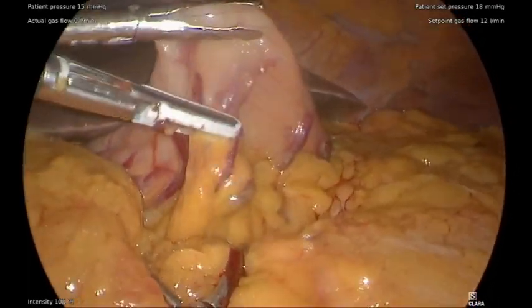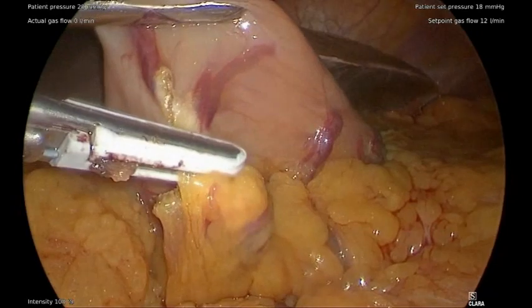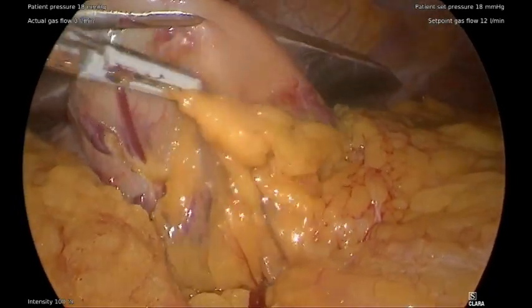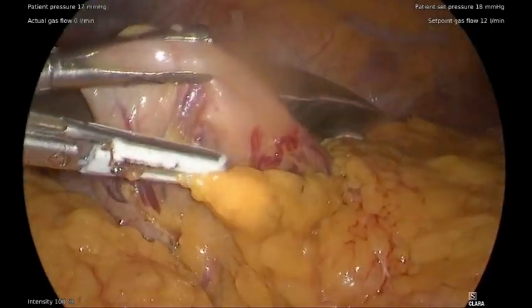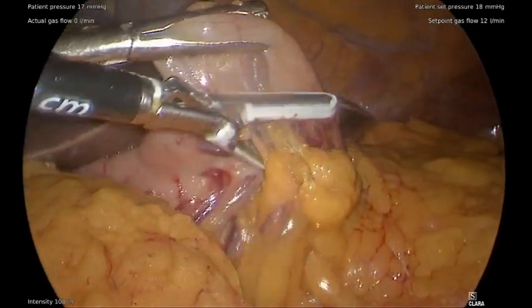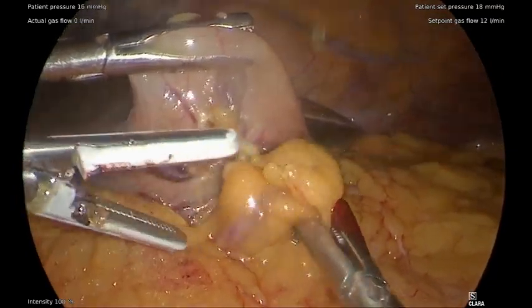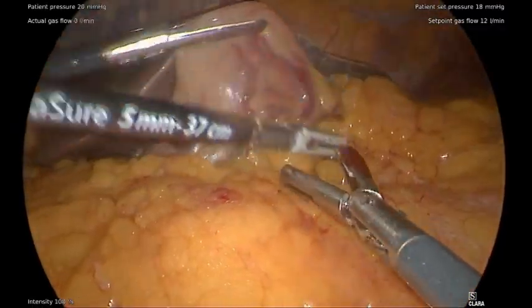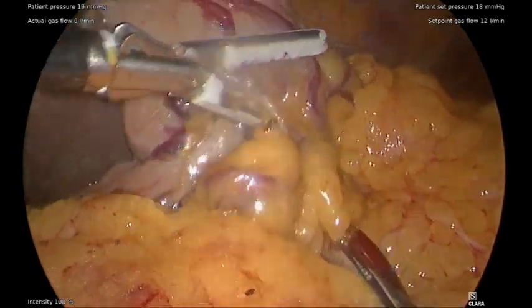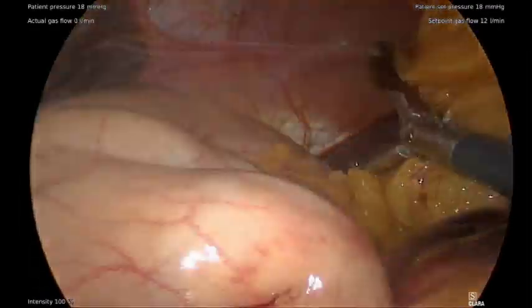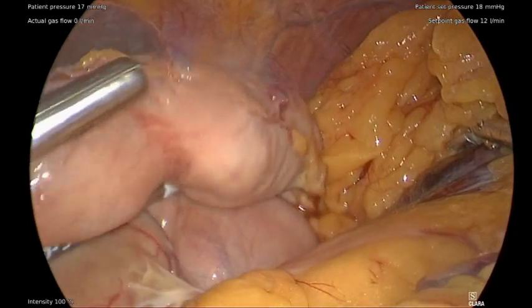Attention was then paid to mobilization of the right gastroepiploic artery off the greater curvature of the stomach. Care is taken to preserve the right gastroepiploic artery as well as not to damage the stomach itself. Here we can see the completion of the mobilization of the greater curvature.